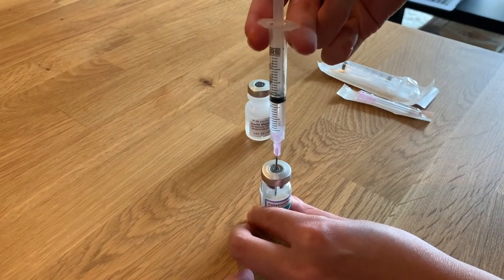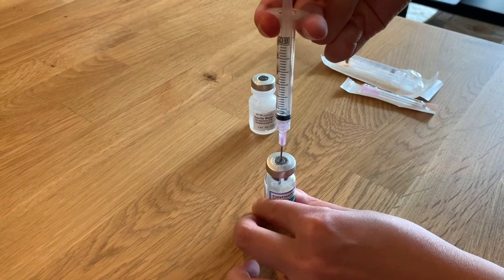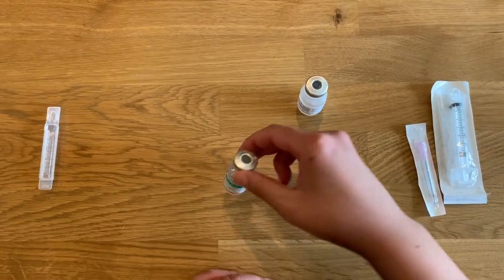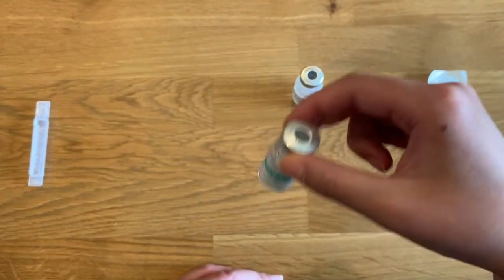Push the needle of the syringe filled with sterile water through the rubber stopper on the colistin vial. Then slowly depress the plunger on the syringe until the entire volume has been injected into the colistin vial. Pick up the colistin vial and swirl gently to mix. Do not shake the vial as this will make the medicine foam.